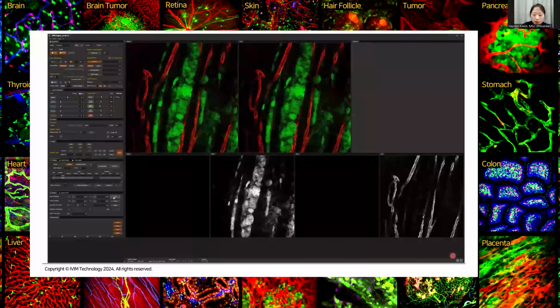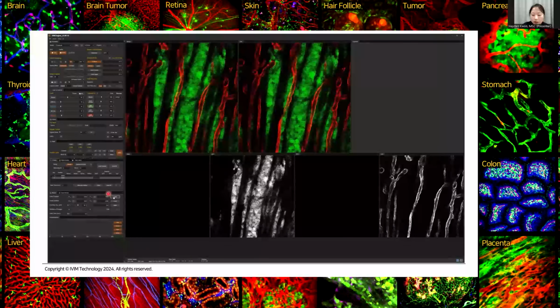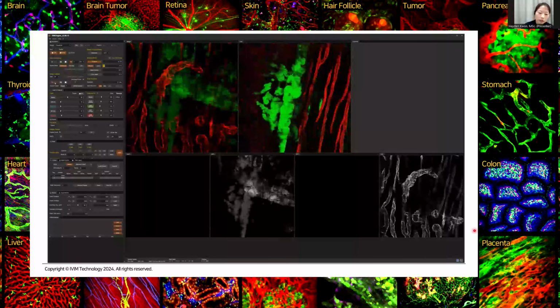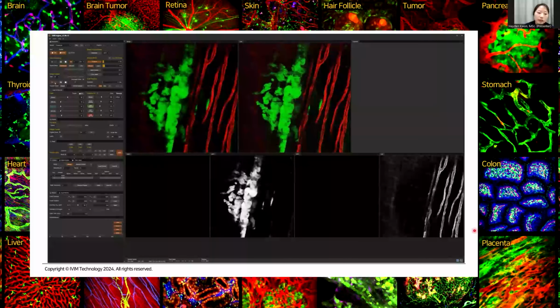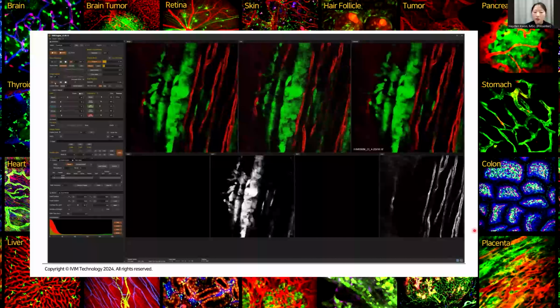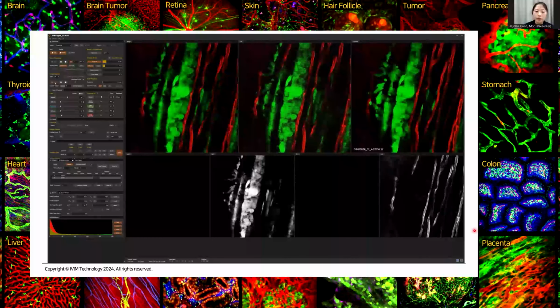Here, in the mosaic imaging mode tab, you can set the start and final coordinates of the region of interest. In this imaging session, the total number of images will be 2 by 2, so 4. After loading the coordinates, you can start the imaging by clicking the capturing key. All the movement of the stages will be automatic.